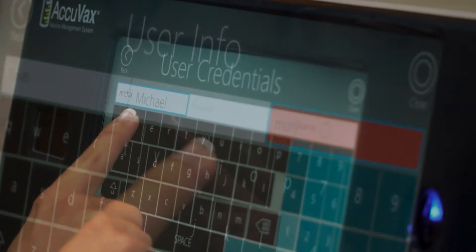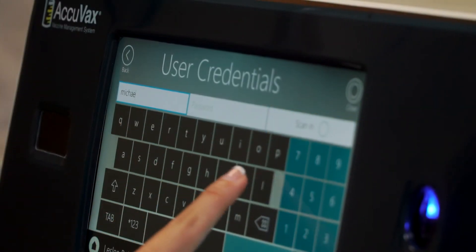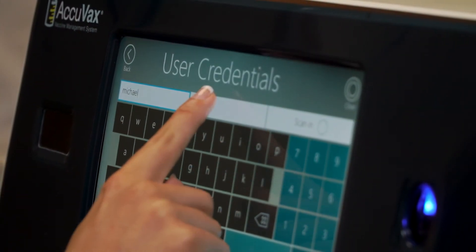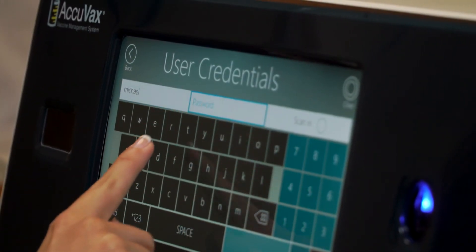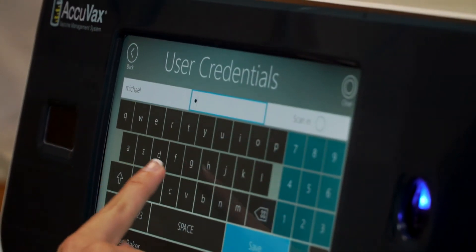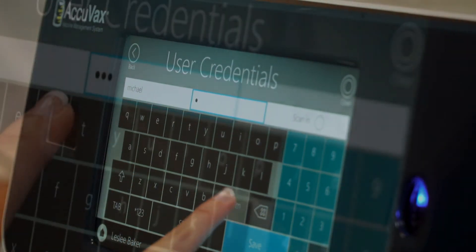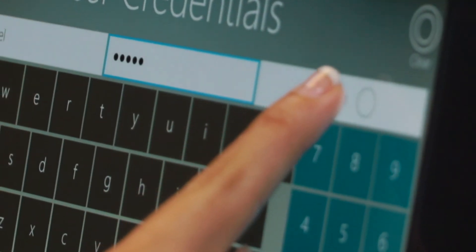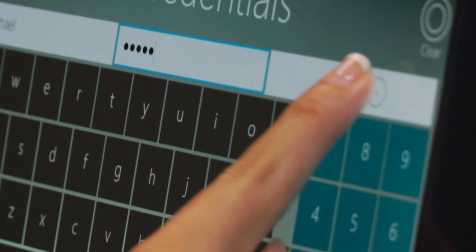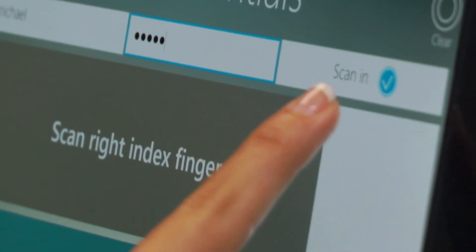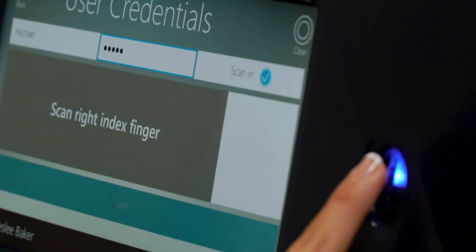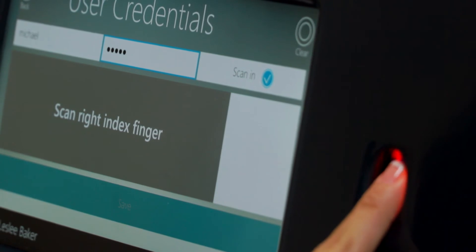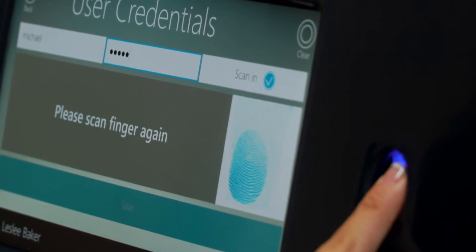On the user credentials screen, input the new user's username and a password. On this screen, you will also capture the new user's fingerprint, allowing them to log on via AcuVax's fingerprint scanner.